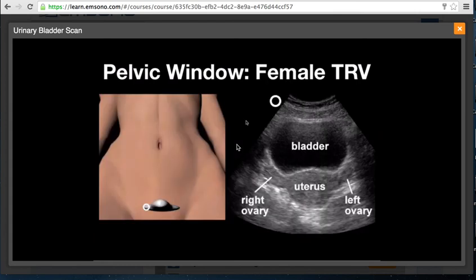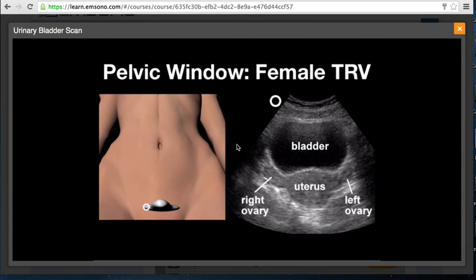Here is a transverse view of the female pelvis. The indicator is toward the patient's right, giving anterior, posterior, patient's right, and patient's left orientation. The bladder is visible with reverberation artifact in the near field, and the uterus is seen posteriorly. From this view you are able to obtain anterior-posterior as well as transverse width measurements of the urinary bladder.